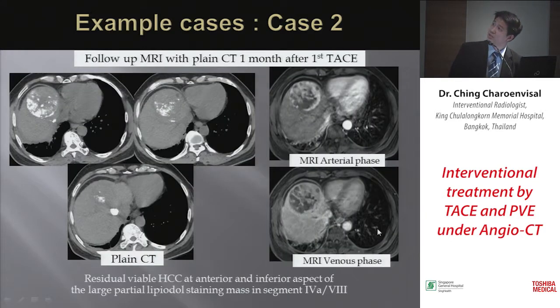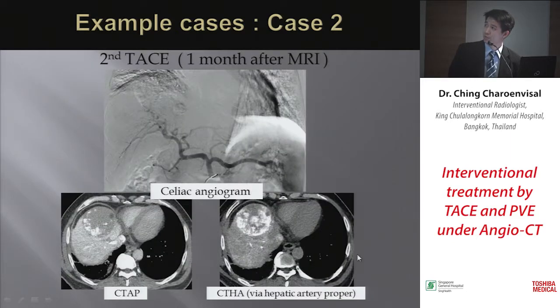But on the follow-up MRI 1 month after TACE, you can see there is only partial lipiodol staining in the large HCC, and the MRI shows much residual tumor here. Then we scheduled the second TACE.